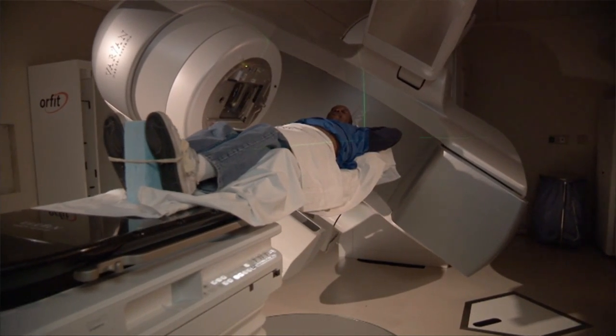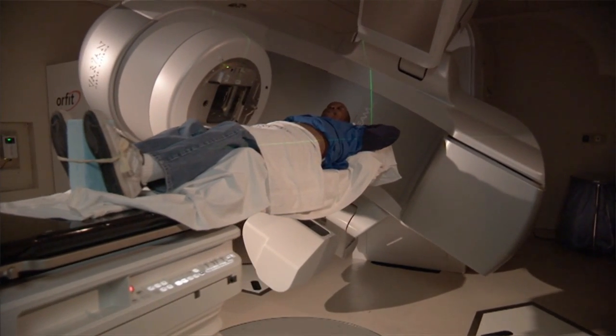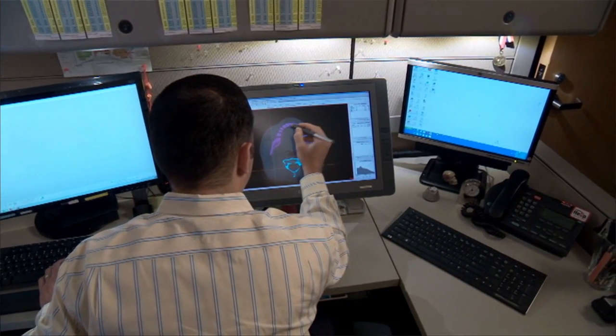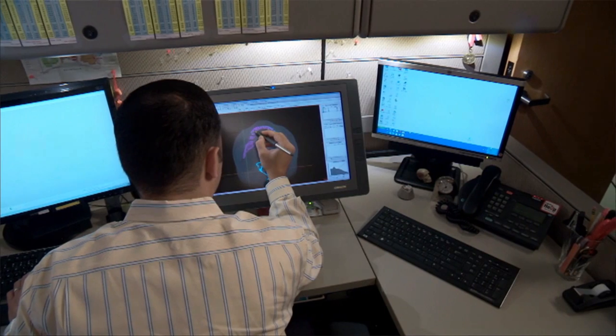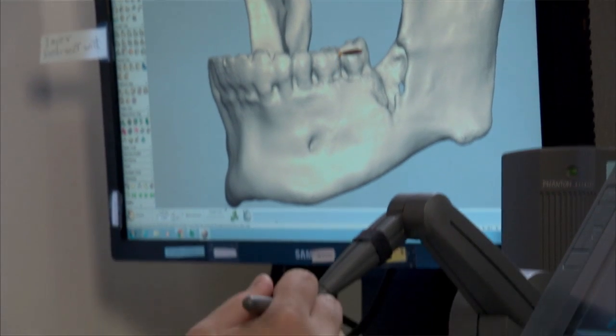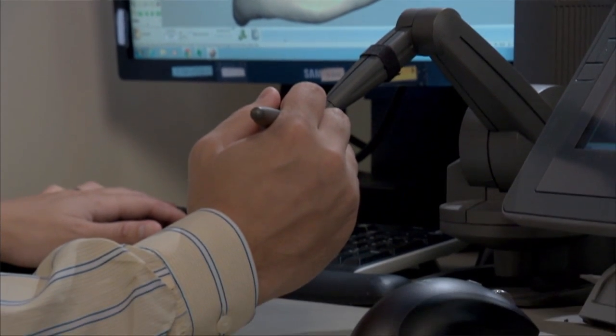Generally when somebody orders something, it comes to us and then goes to Dr. Leo Kouris, my PhD biomedical engineer. He evaluates how difficult it is — if it's very difficult, he may do it himself; if not, he puts it out to one of the other technicians. They take whatever the image is and put it into a format so it can be printed, or design something if that's what's requested. Once that's done, they move it to our production guy, who brings it over and puts it on the machines to build it.